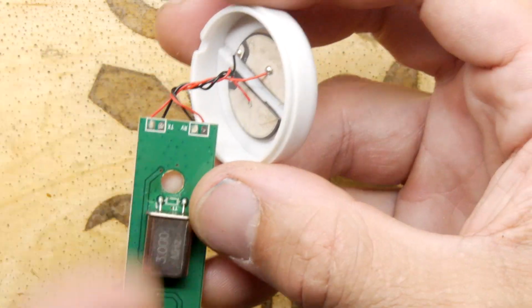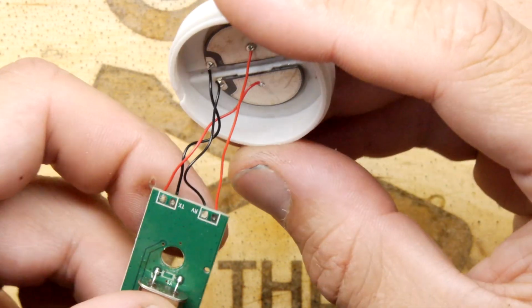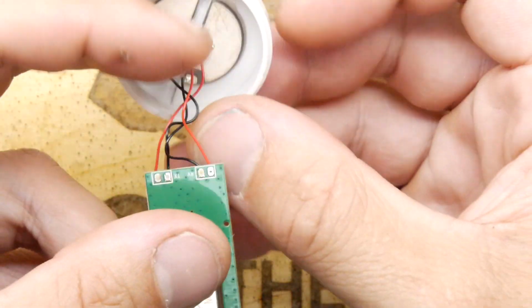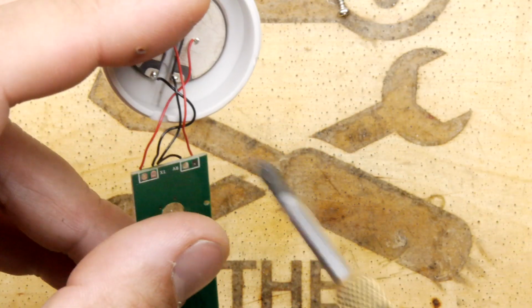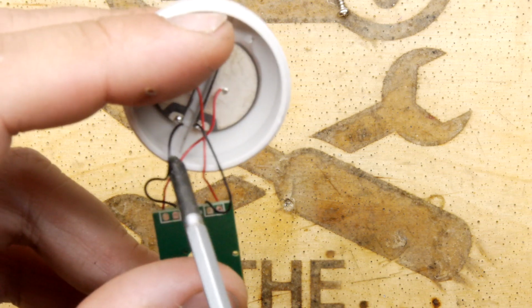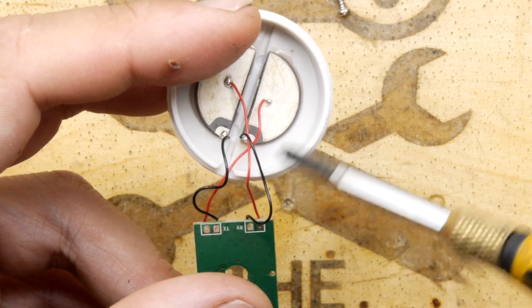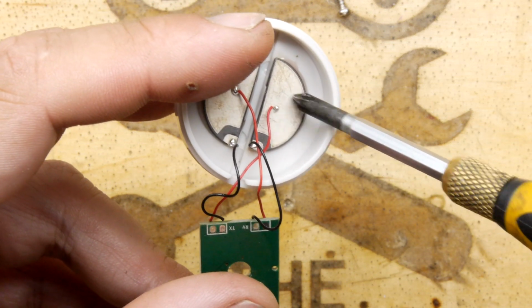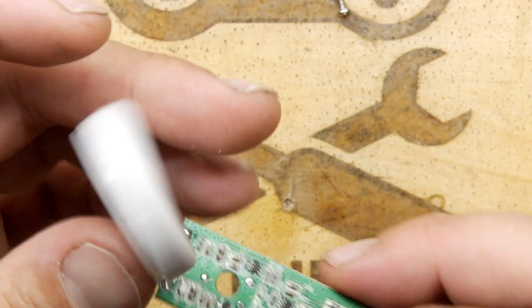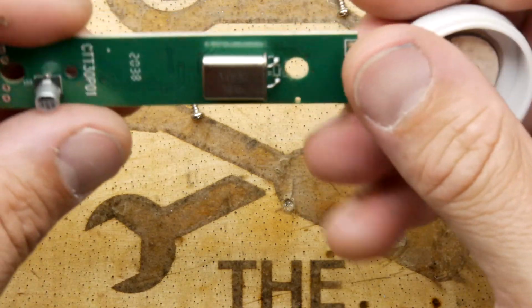And if we turn this over, you can see which one is a receiver and which one's the transmitter if we unwind it. The transmitter is TX. It's weird actually. Let me just pick apart these wires. They're a bit confusing the way they are. There we go. Huh. So that's not what you'd expect. So you have TX here and RX, but the red wire of the TX goes to here, but the black wire of the TX goes there, and then the RX. So maybe it doesn't quite mean what I think it means. That word might not mean what you think it means.